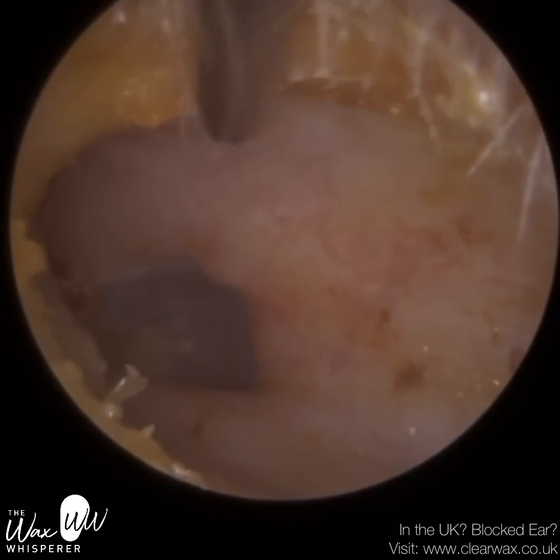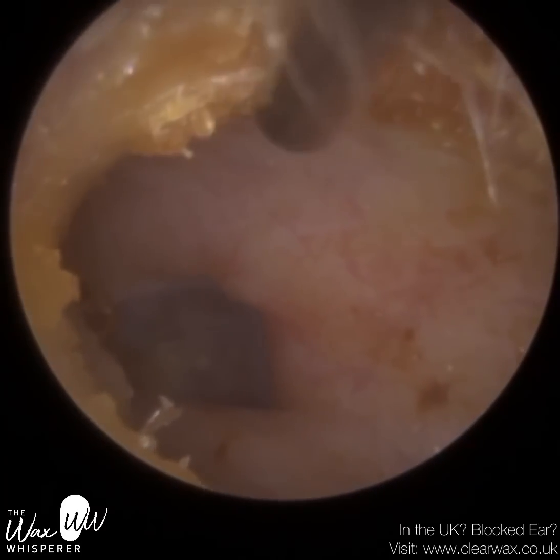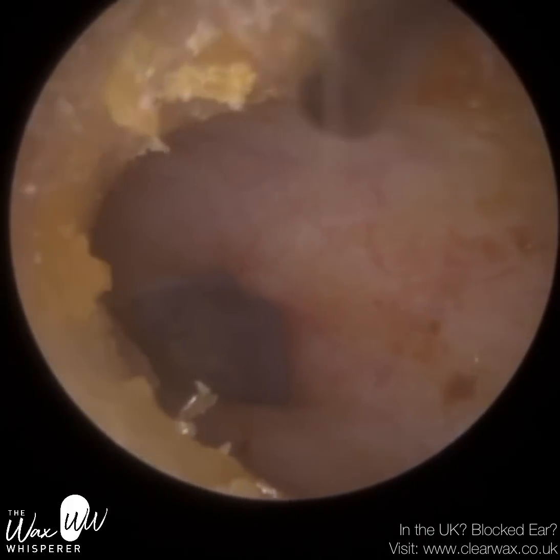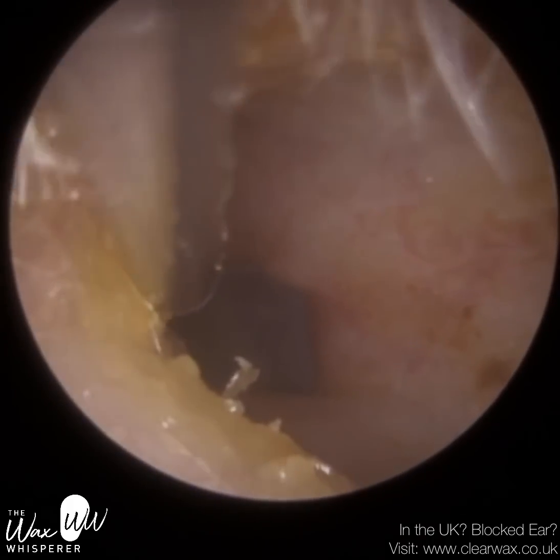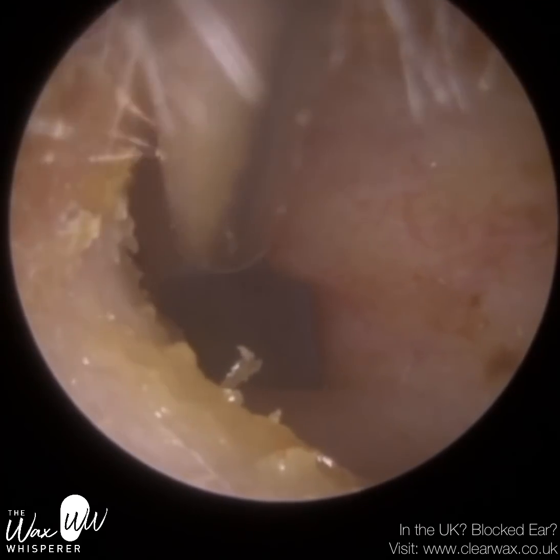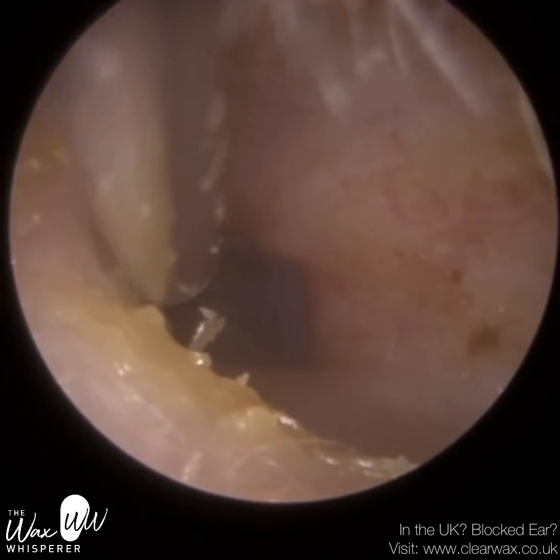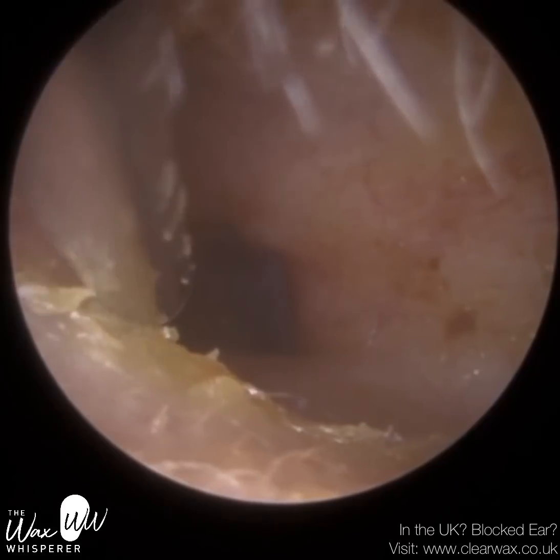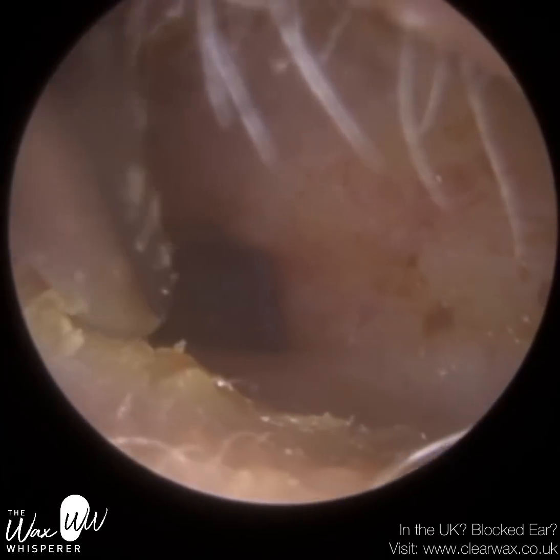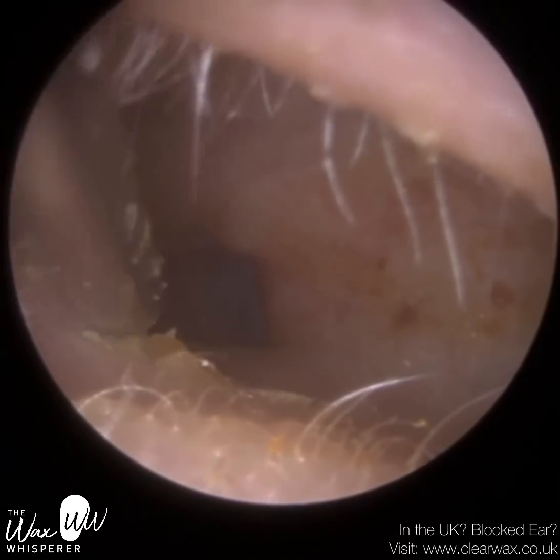Now on occasions these bony spurs can prevent the dead skin from migrating out of the ear, which can lead not only to a buildup of dead skin within the ear canal, but also earwax, because earwax is reliant upon the dead skin migrating out of the ear like a conveyor belt. As the dead skin migrates out of the ear, any earwax sitting on the surface of the dead skin also comes out. So if the skin can't migrate out of the ear, then the wax can't. So we're just going to remove that.